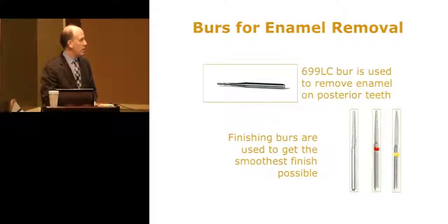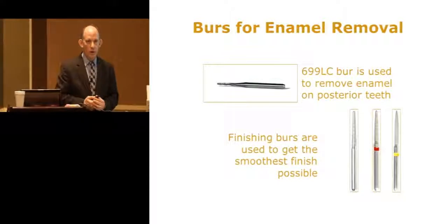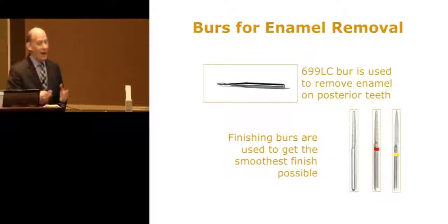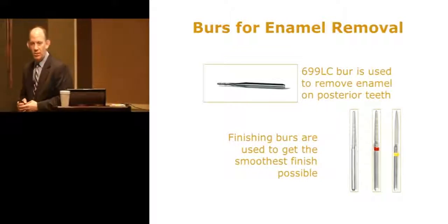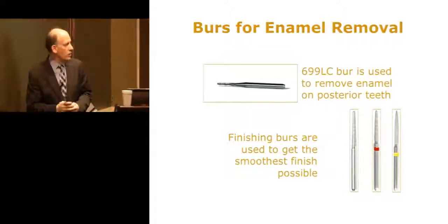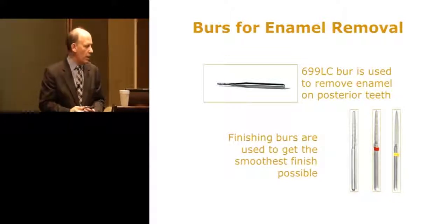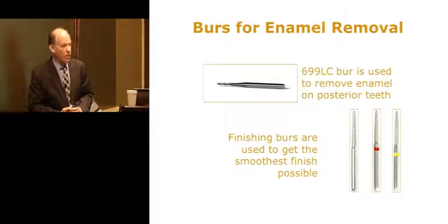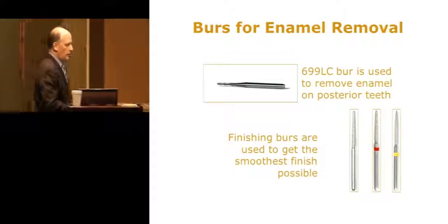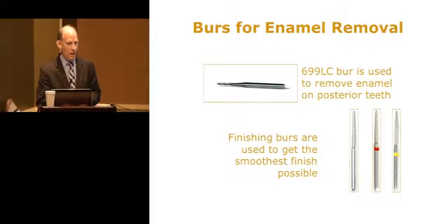This is the 699 burr. It's more for premolars, if you're going between the premolars. I'm sure if you're in an office that's well stocked, you already have some burrs that you like. I'm just showing you what I think works pretty well. And again, this is not like my ideas. These have been proven for a long, long time now. Just remember that when you go in and you strip, you need to make sure that your surfaces are polished and not sharp, or that they don't have any sharp edges.